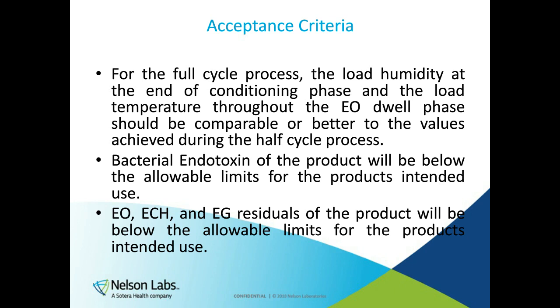Your bacterial endotoxin of your device must be within the requirements as outlined in ST72. That's depending upon whether it's blood contacting or cerebrospinal fluid contacting. And then of course your EO and ECH residuals of the product will need to be below the allowable limits for how the product is intended to be used.